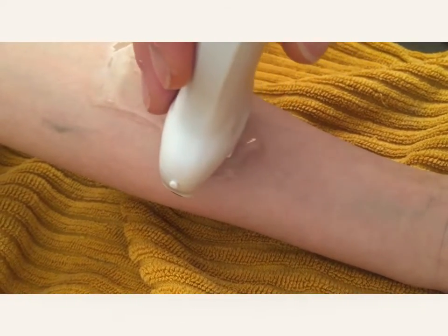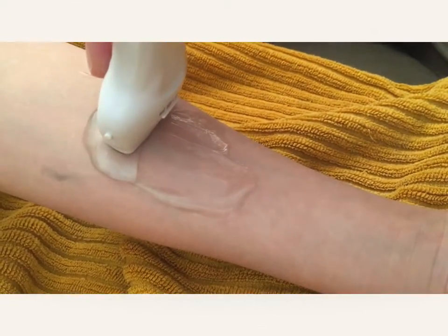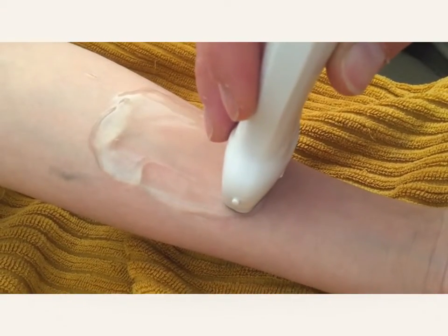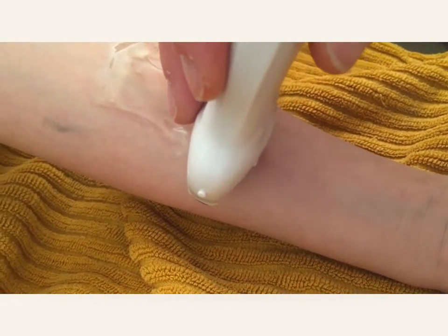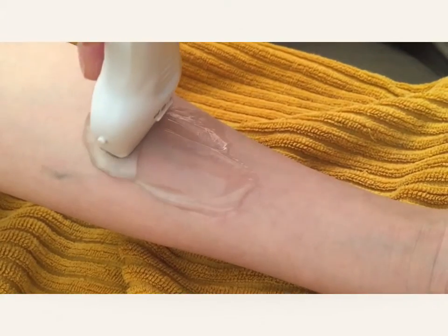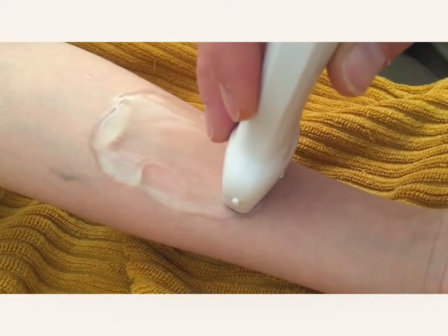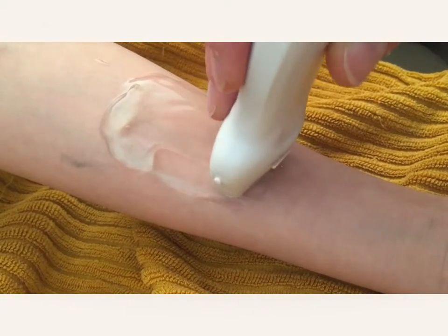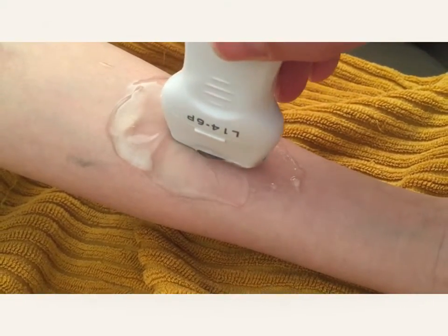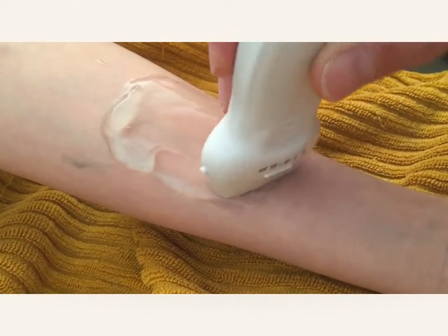Now, to perform this, we start in the transverse plane over the area of interest. We slide the probe across the area of interest while staying perpendicular to the skin. If the area of interest is greater than the width of the probe, slide the probe to the side and repeat. You can repeat the scan of the area of interest in the longitudinal plane, taking multiple sweeps to cover the area if necessary.